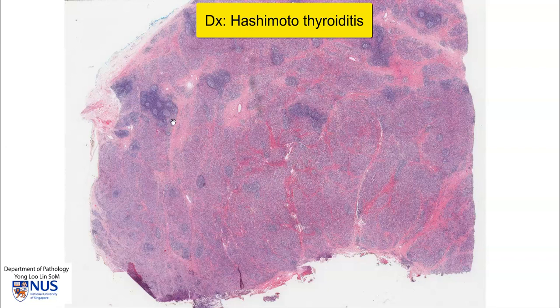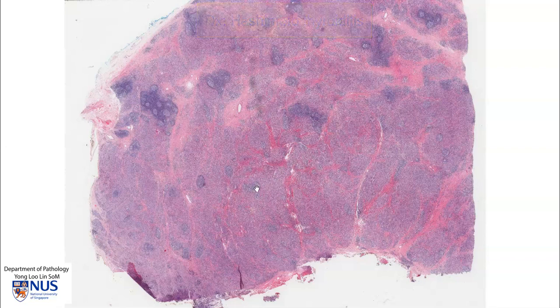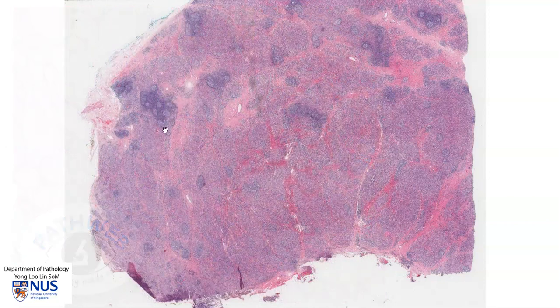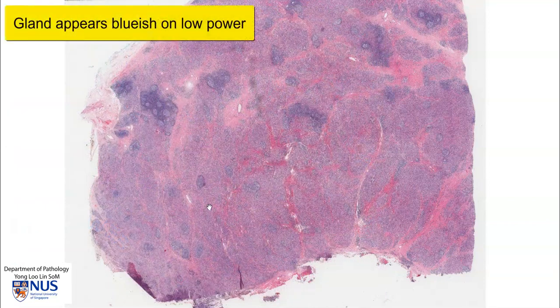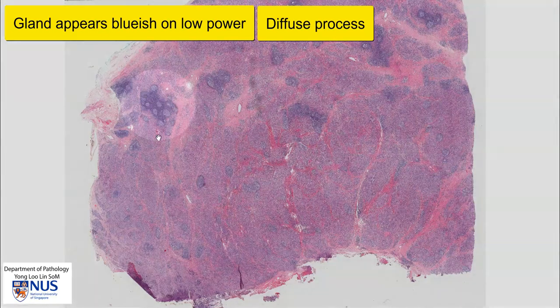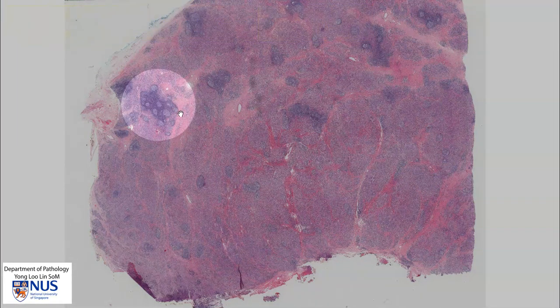Microscopically, we can see that the whole gland looks very abnormal. Instead of seeing the usual thyroid follicles filled with pink colloid, the gland actually looks a lot bluer on low magnification, and this is quite a diffuse process. We can also notice some very interesting looking areas which I will zoom into later.